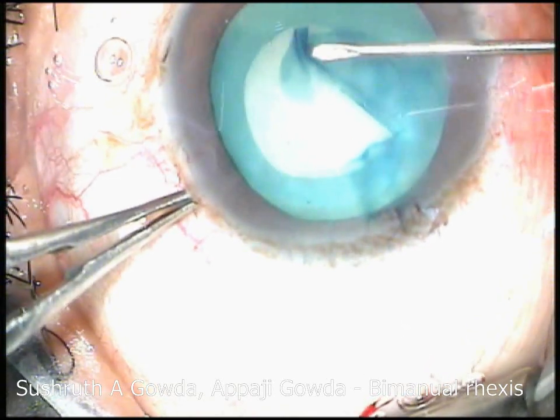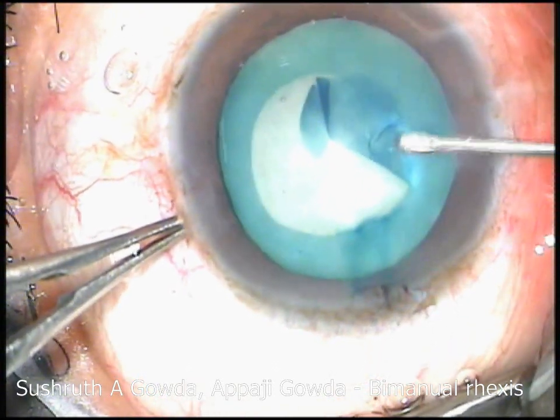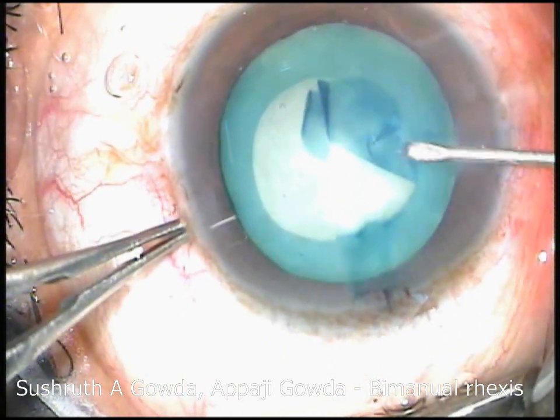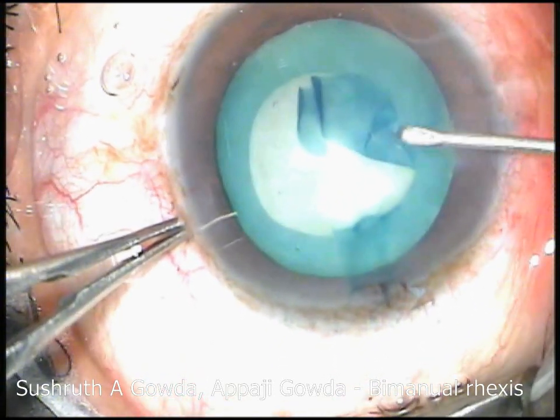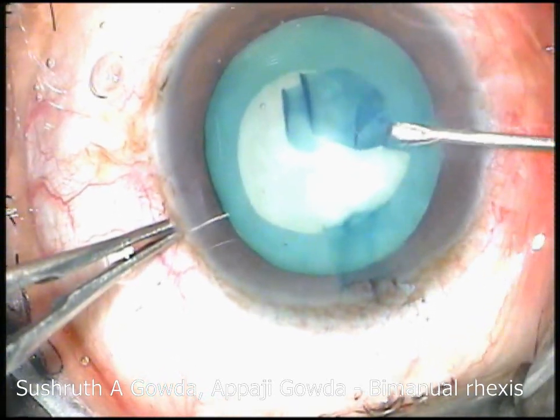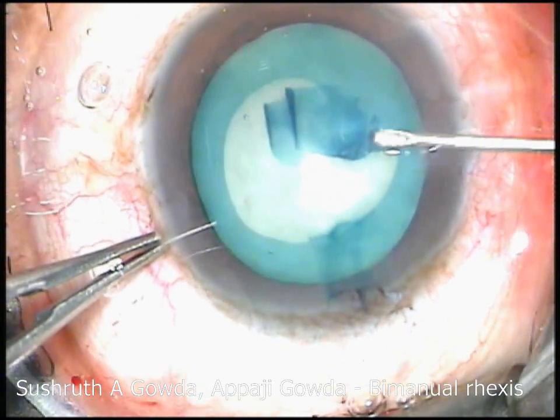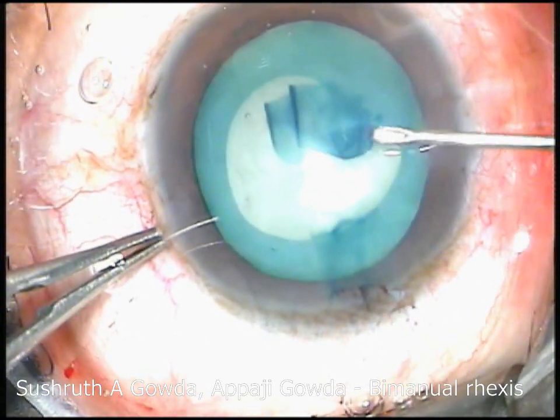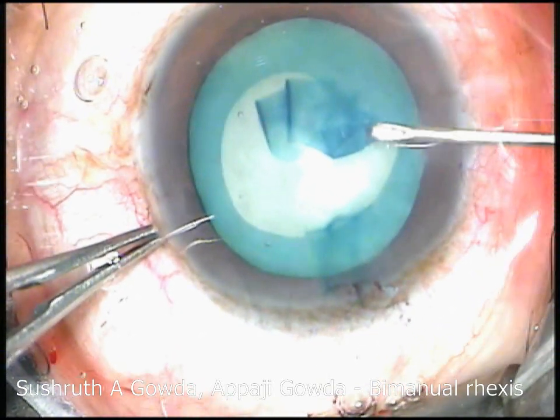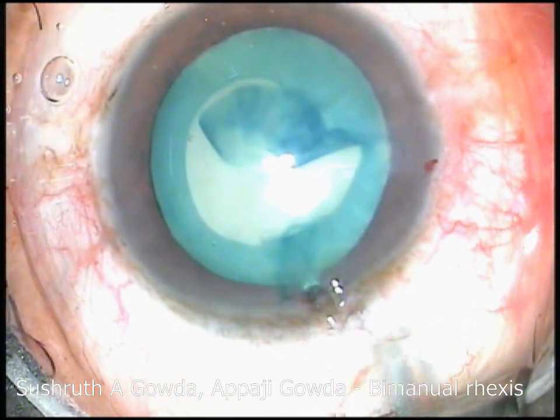You can see over here I am re-adjusting the flap, and it is actually running off towards the periphery, and I even puncture the capsule over there. While re-adjusting the flap, loads of HPMC escape through the side port and I abandon this procedure.